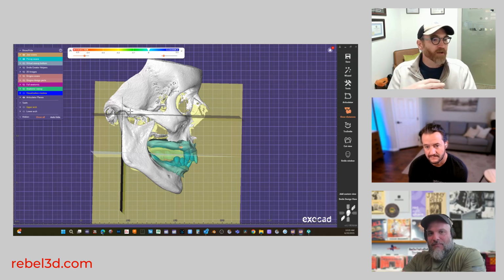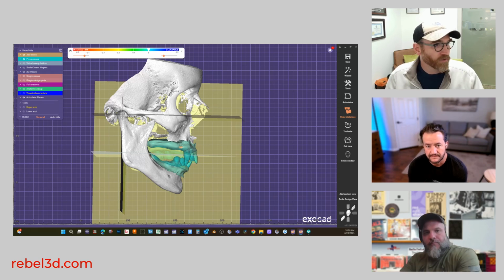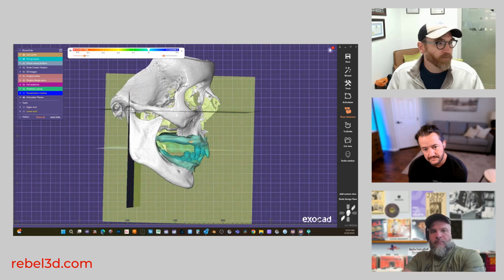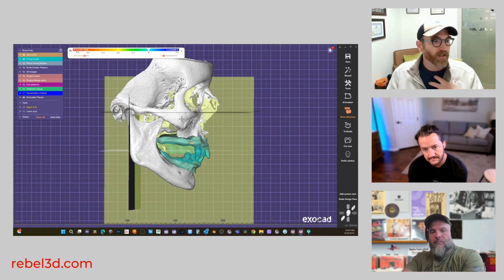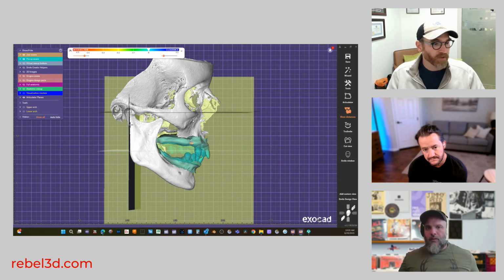That's our obligation to you as a clinician: you give us data and we will make it to the data that you give us. That's our duty and responsibility to you. And so I think the point here is that, for me at least, it gives me a lot of comfort when I start out with a lot of information about the patient.